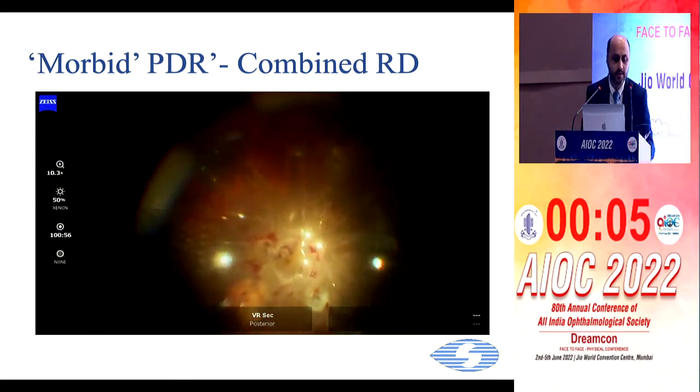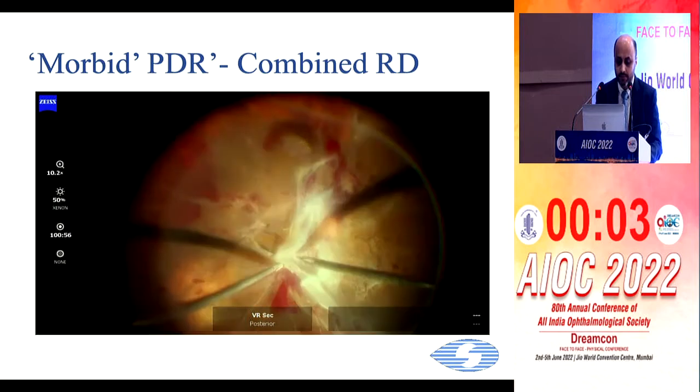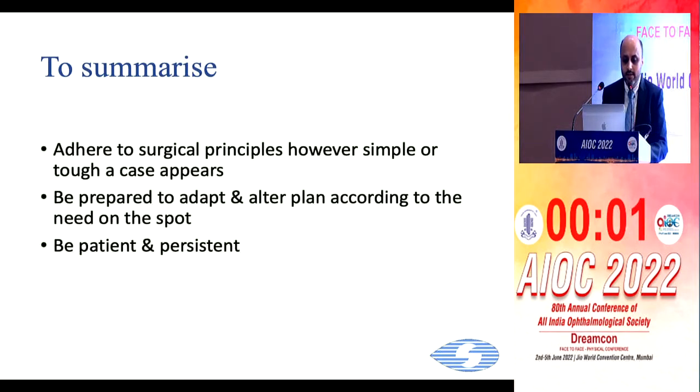And finally we completed the case with tamponade. So to summarize PDR vitrectomy, my take would be that understanding vitreous cases and finding the right plane of dissection is very important. I think we should do that first and adhere to the surgical principles, whatever the case may be.